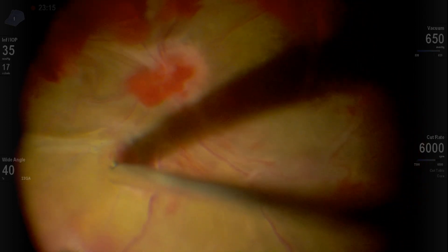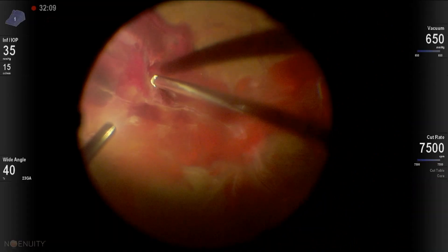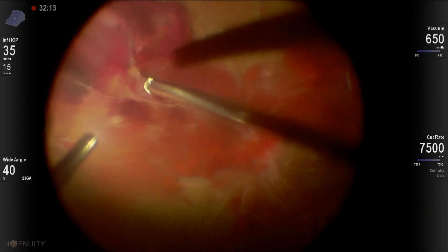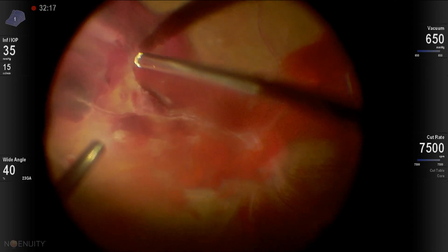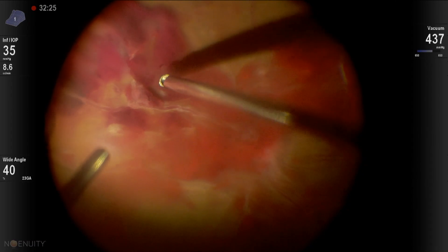Again, the 23 gauge cutter is fantastic for cutback delamination when it sits loose. Then here more dissection continues, and once you open the membranes, you can access the peripheral vitreous.